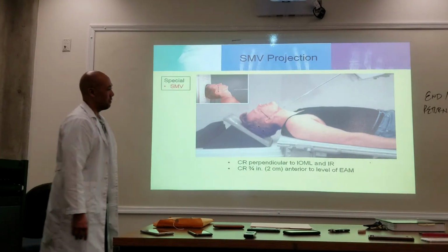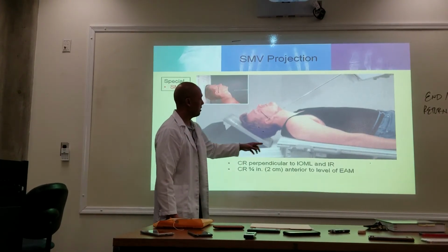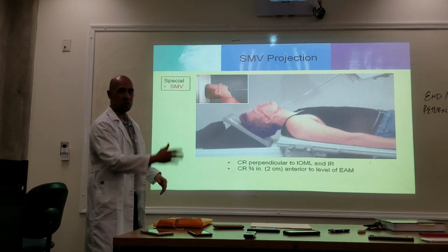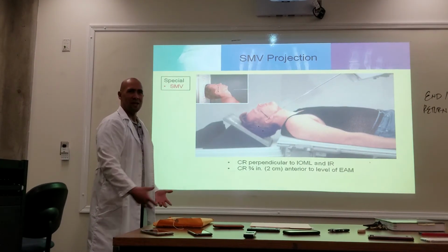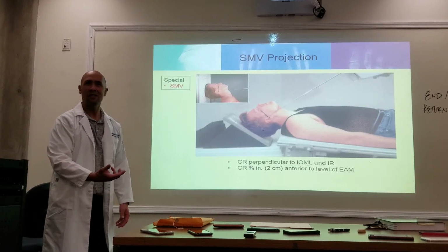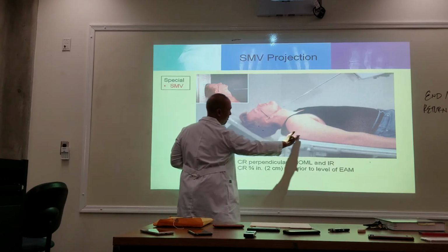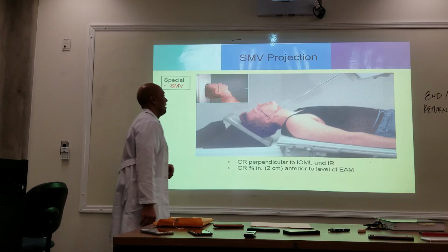Now if you do them on the table, you can also do it this way. They put the patient at the edge of the table. Then they got, looks like, a laundry basket, the blue thing. I haven't been in the hospital in a long time. What do they call them now? The linen basket? Soiled linens. Okay, the basket with the top on there. They use that to place the cassette on top. So they literally left them hanging off the edge with the head dangling off the side.